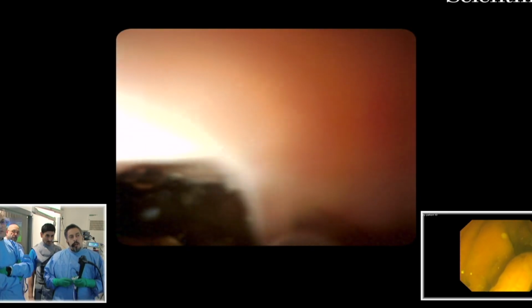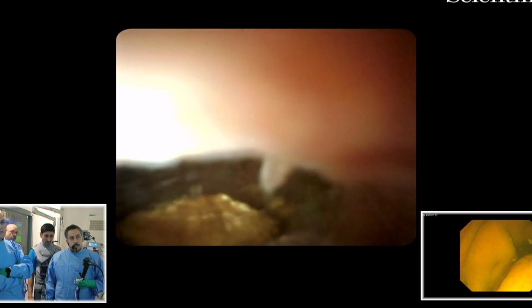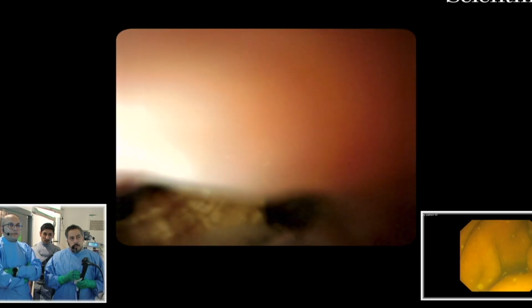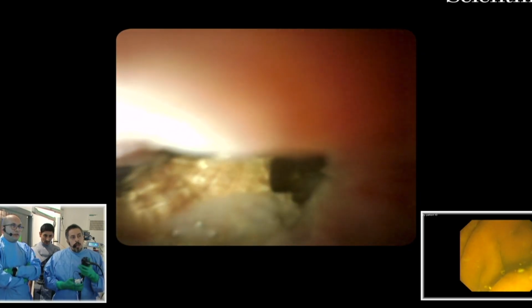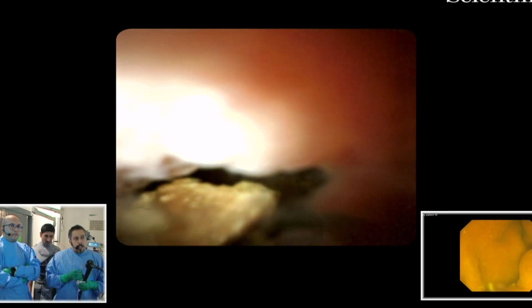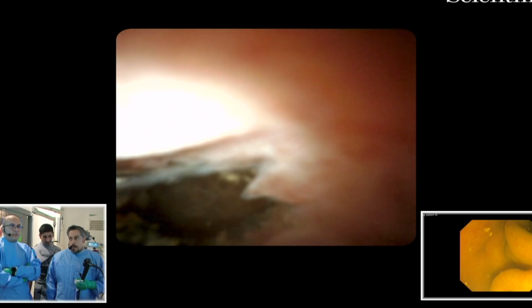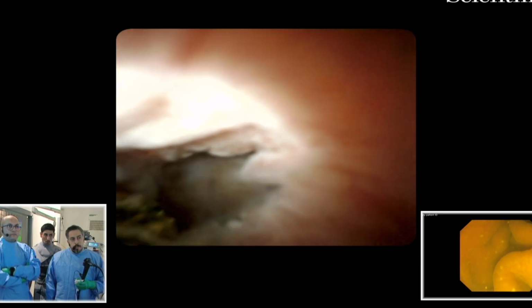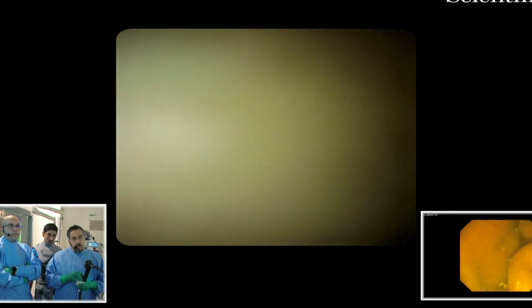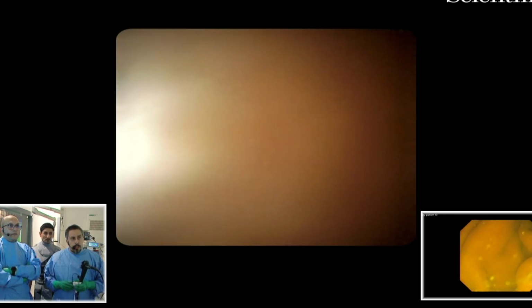So, Mohammed, after crushing and clearing with the balloon, and then you discharge the patient, do you give him a course of antibiotic? Or just you put the stent? Antibiotic? You crushed it to small pieces. I don't give him a course of antibiotic. I only give intra-procedural antibiotic, unless the patient is a liver transplant patient or immunocompromised or PSC patient. So the question was, do you continue antibiotics for a few days after or just pre-procedure? It's only pre-procedure.